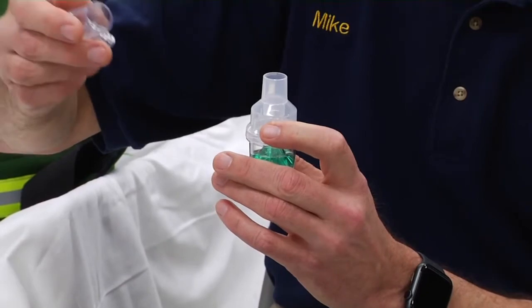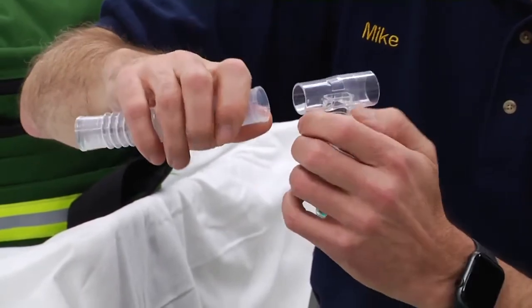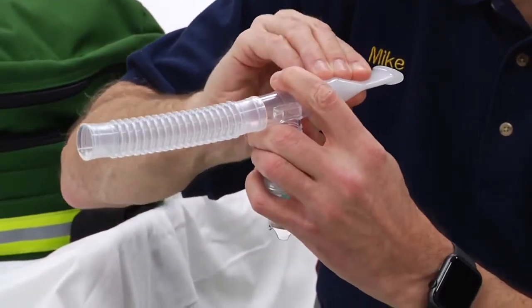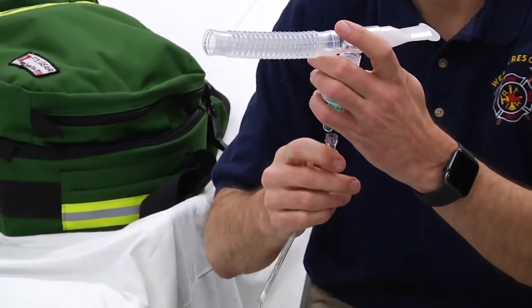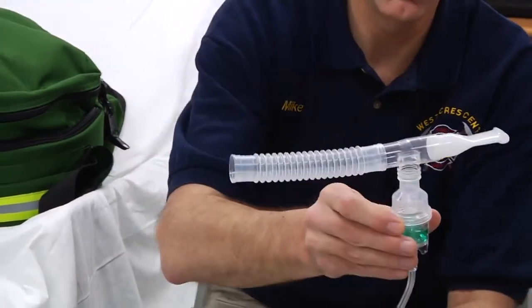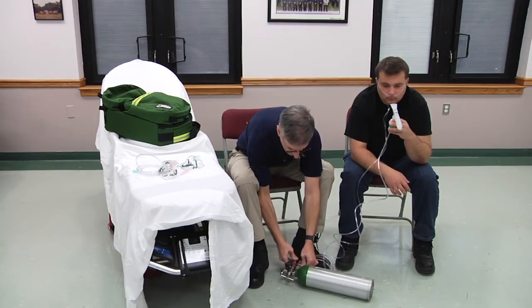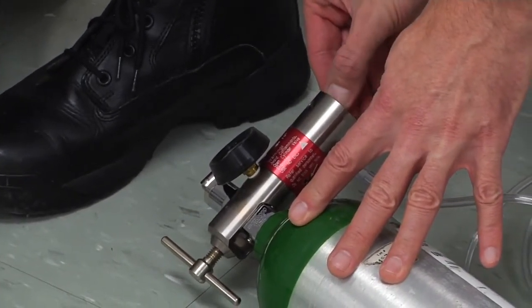Typically, a T-piece is inserted on top of the nebulizer with an extra piece to allow the medication to leave the nebulizer and then be inhaled back into the patient through the mouthpiece, which goes on the other end. The oxygen, or whatever gas is being used to power it, plugs into the bottom of the nebulizer. We'll ask the patient to hold the nebulizer, disconnect his oxygen, plug the nebulizer into the oxygen, and turn it on to a flow rate — typically somewhere between 6 and 8 liters per minute.